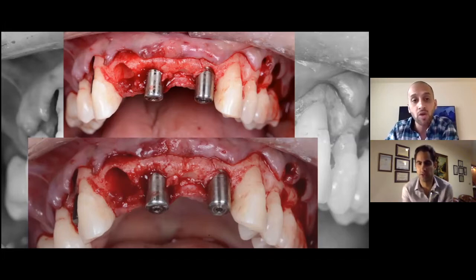And also, because of the pontic space here underneath the lateral, because this is an extraction socket, I felt like I could do a better job developing the pontic space underneath an extraction socket than a heal bridge. So there is a difference for you in shaping the papillae between the pontics or the cantilever. So both ways work for you.